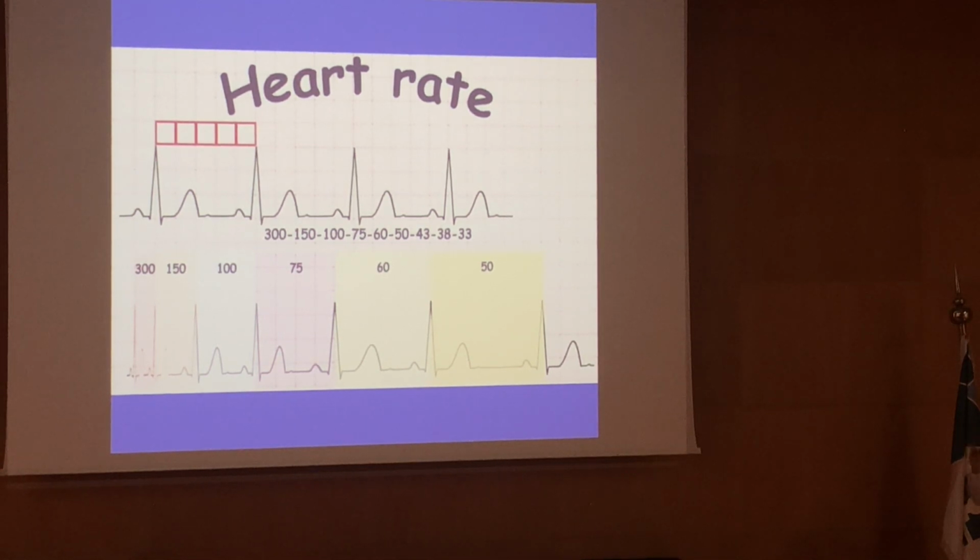So you look at the RR interval. Like this case, for example, RR is totally irregular. It is continuous. This is just an example to show you the calculation of the rate. Suppose this is for a patient and the RR is very variable. We take 10 seconds. How many QRS complexes? This is the heart rate in 10 seconds. I multiply by 6 to bring me 1 minute.